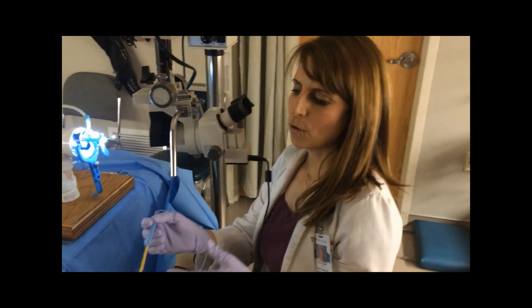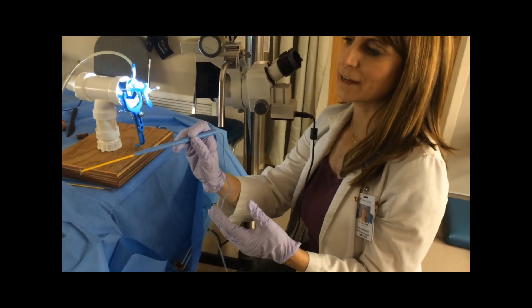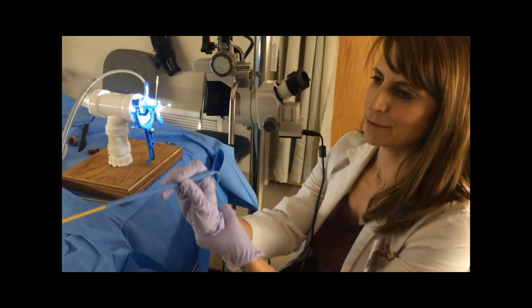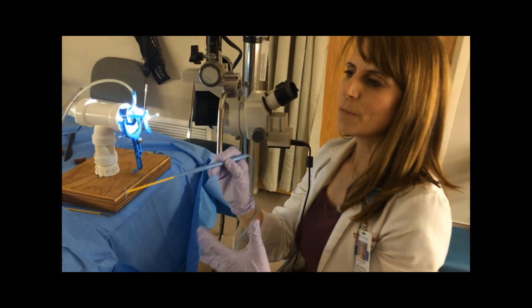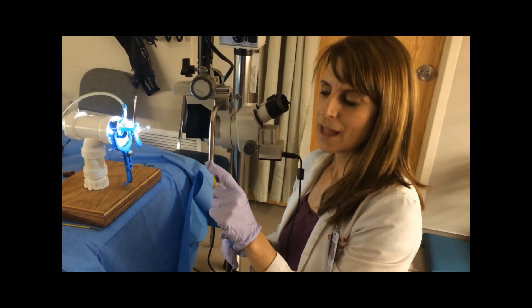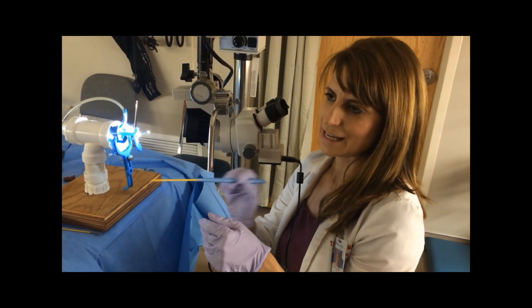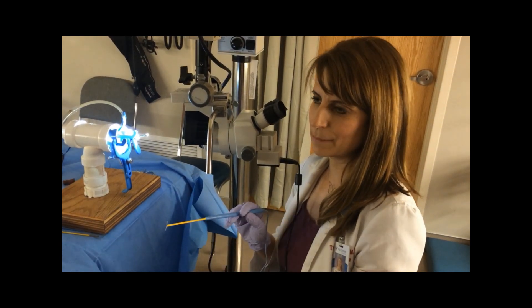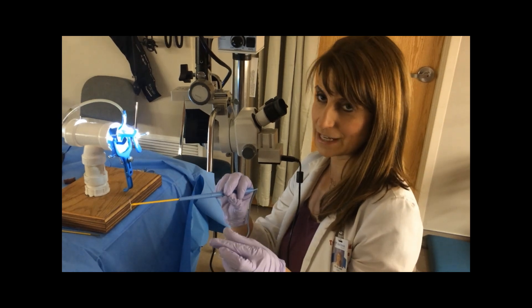The hand position that works best for me is to hold it like a pencil, then grasp my wrist, and I'm rather dramatic with my body motions — going into the cervix, across, and then straight back out. The most common mistakes are that the doctor does not bury it all the way to the bar, or goes too fast where there's drag and then is not able to excise the entire specimen. That will happen even with the best colposcopists, and sometimes you have to do what's called a revision and go back and trim off the remaining cells.